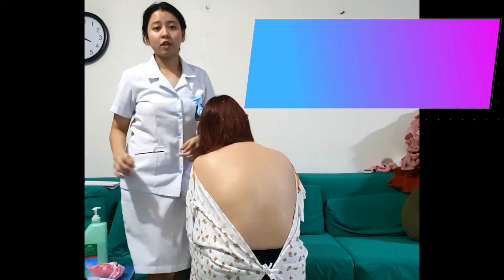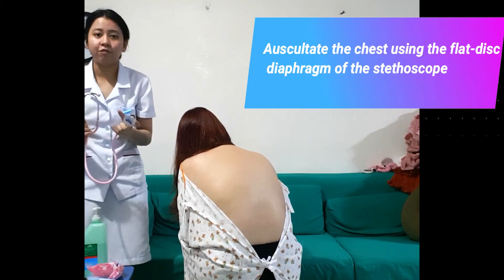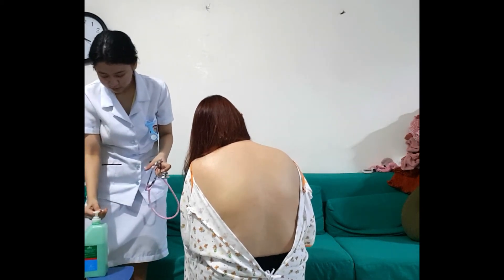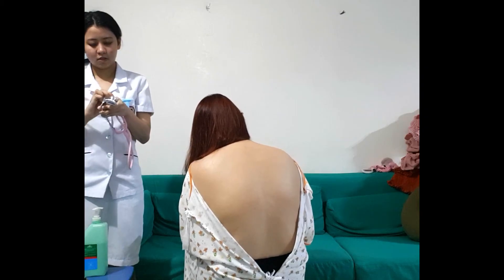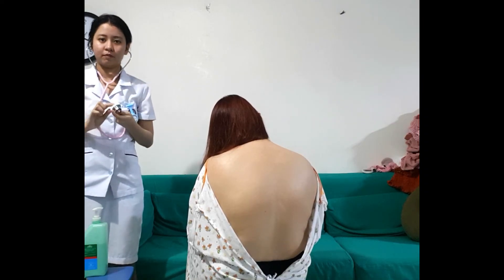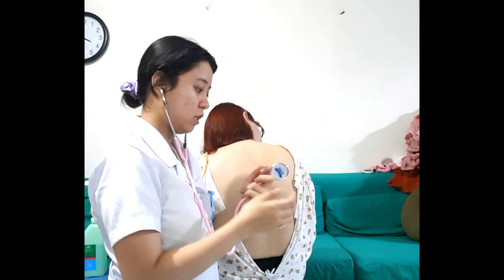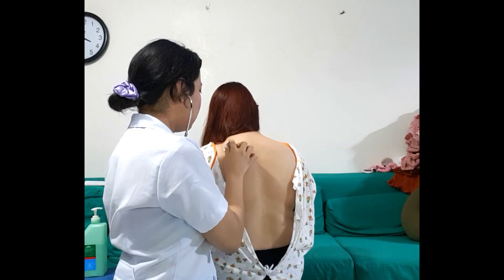Next, we will auscultate the chest using the flat disc — the diaphragm of the stethoscope. Let's clean it first, including both ear pieces. We will use the systematic zigzag procedure used in the percussion. Make sure it is open.